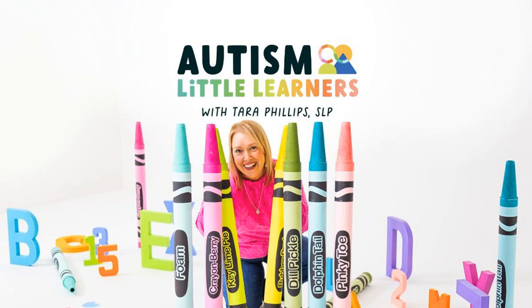The second area we'll talk about is building AAC into snack and mealtime. Snack, lunch, and dinner times are some of the most powerful communication moments of the day. Food routines are usually really motivating and sensory rich, which makes them ideal for AAC learning. We can model eat, drink, different, like, don't like. We can offer choices. We can say, do you want, and then press juice or milk and model the word while we're saying it. We can encourage social connection during these times.